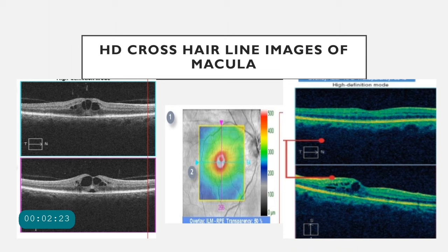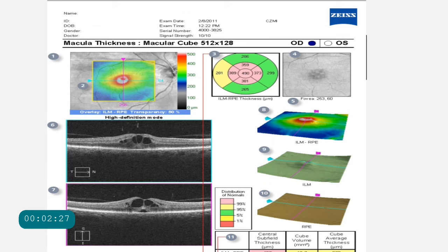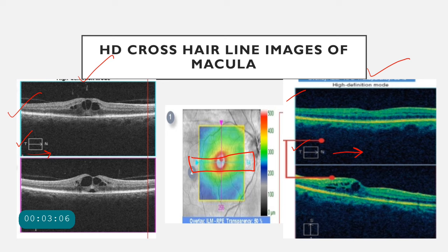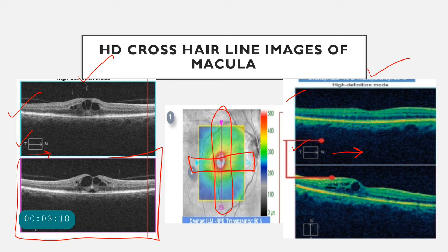After that, we have the HD cross-hairline images of the macula. You can have black and white images or color-coded images. The first image represents the cross-hairline image taken in the horizontal direction — from temporal to nasal, as indicated by the arrow in the box. The pink box represents the vertical cross-line image taken from the macula. So this is the vertical cut of the macula, and both the horizontal and vertical cuts are the high-definition cross-hairline images of the macula.